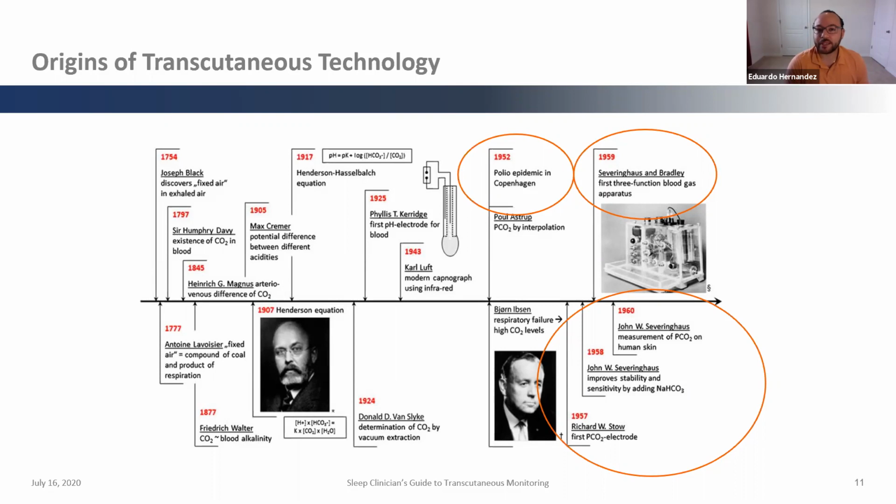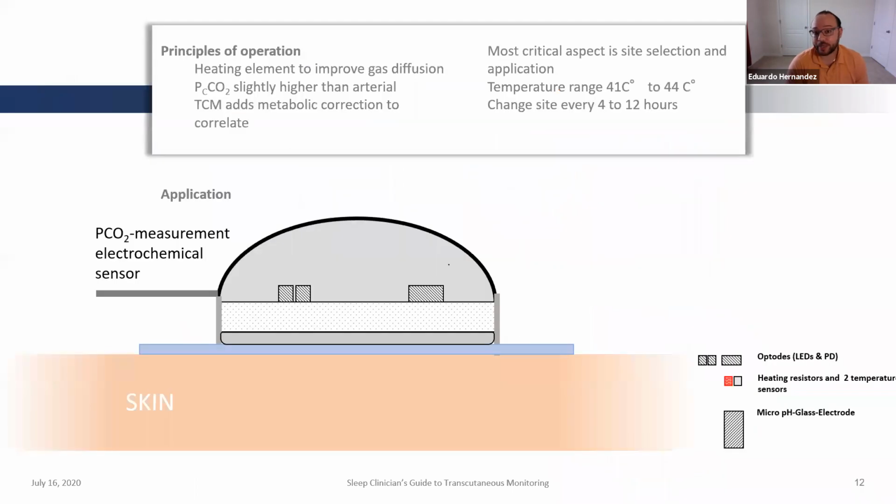The recent digitalization of sensor technologies has really given us a lot more sensor stability, more robust signals from the TCO2 sensors, and also longer site times. That's very important when we're talking about continuous and non-invasive monitoring, that those site times can be monitored up to 12 hours per patient without having to recalibrate the sensor and potentially lose some data in between. So let's go over a little bit of how these sensors work.